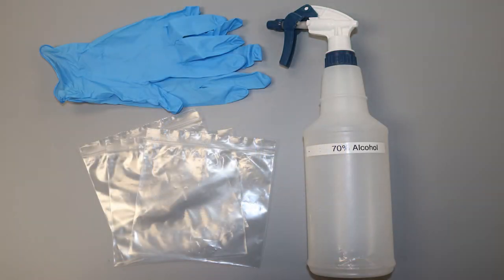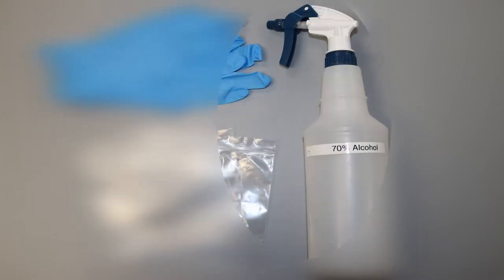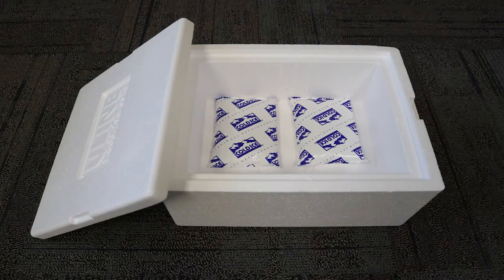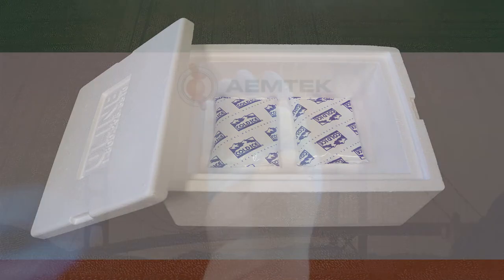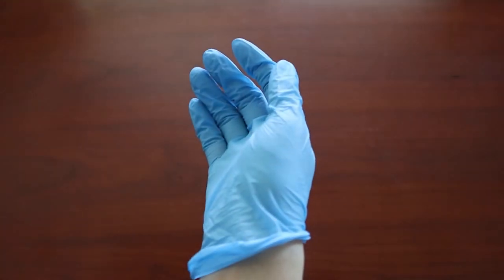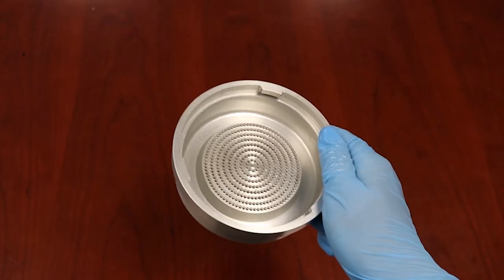You may also need additional materials such as Ziploc bags, disposable gloves, an alcohol-based spray, and an insulated cooler box with ice packs for shipping. Put on gloves before handling any microbiological samples. Use the alcohol spray to disinfect the sampling head before and between each use.